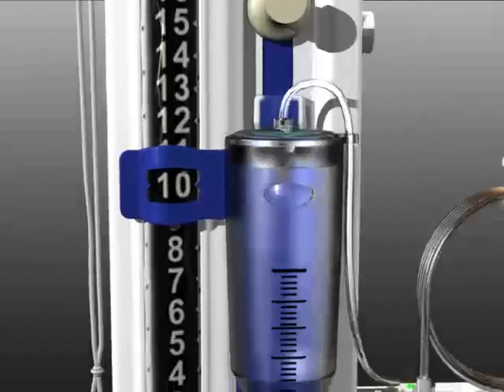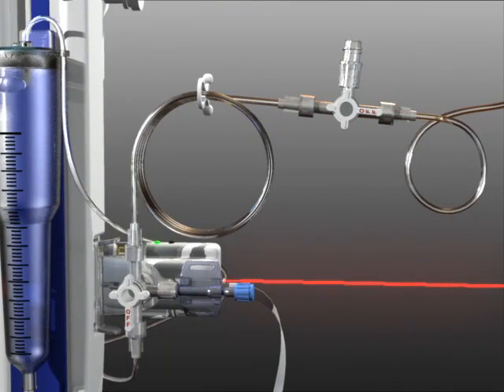Once setup is complete, the system can be open to drainage. Rotate the patient line and main system stopcocks so fluid can flow from the patient to the drip chamber.